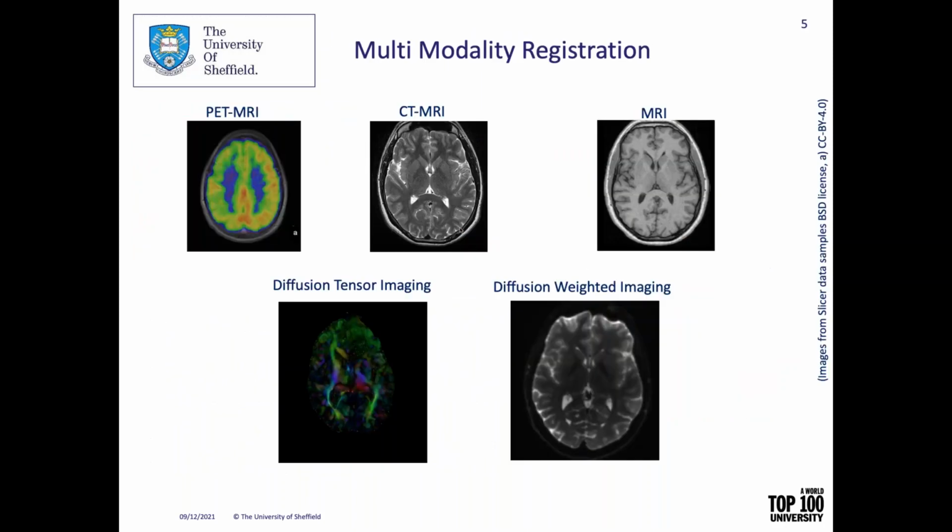So these technologies can produce different types of images. For example, MRI images. These are images of the brain, and they're taken with different methodologies and technologies. The MRI is a scan of magnetic resonance, and there is also positron emission, another image generated which explains the function of the brain. So when we analyze these images, we have a multimodality set of images which can highlight different functionalities of the brain, different information in the brain.